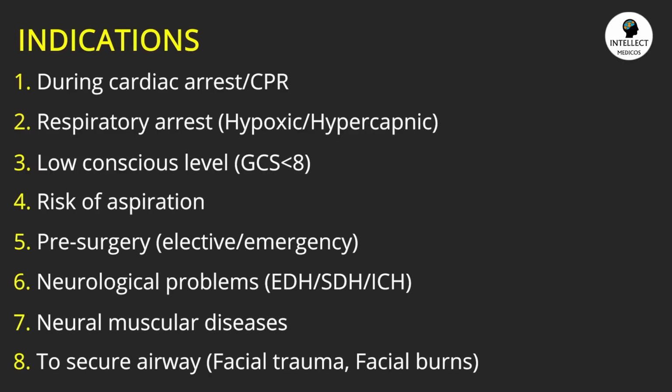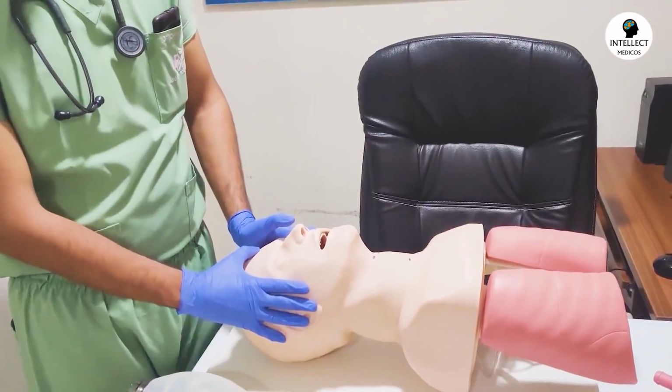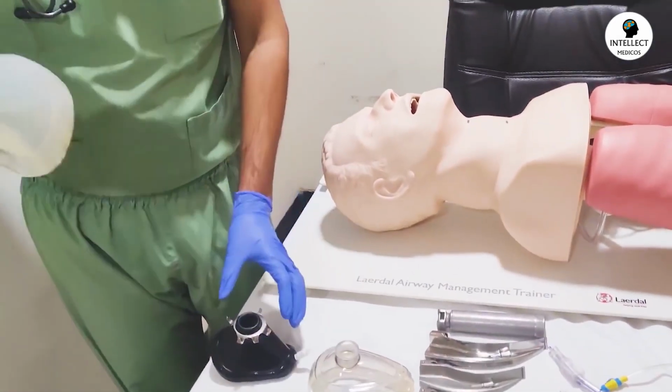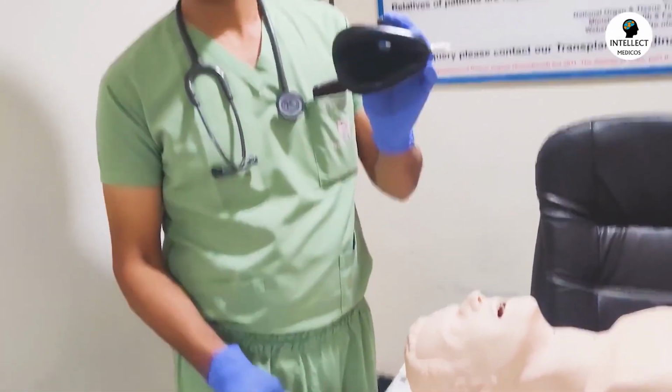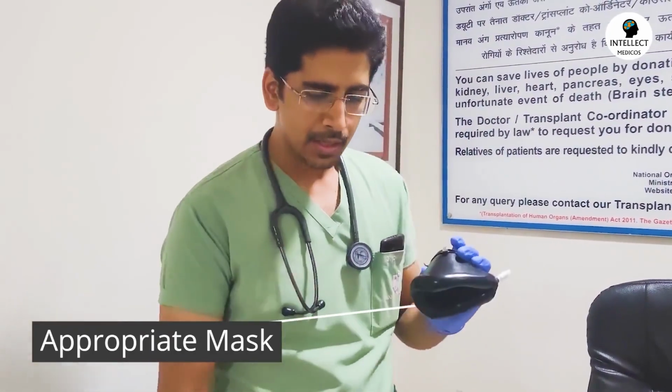Now coming on to the equipment which is required during the intubation. First of all, this is our mannequin or a dummy on which I will demonstrate the whole procedure. And this is our resuscitation bag. This is the mask. We need to have different sizes of mask.